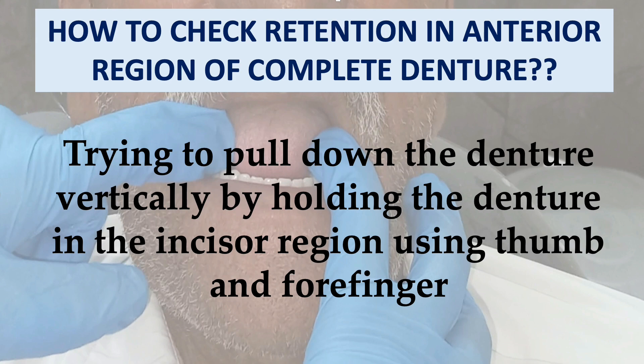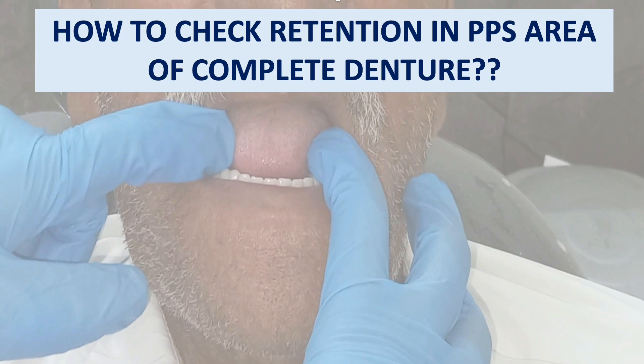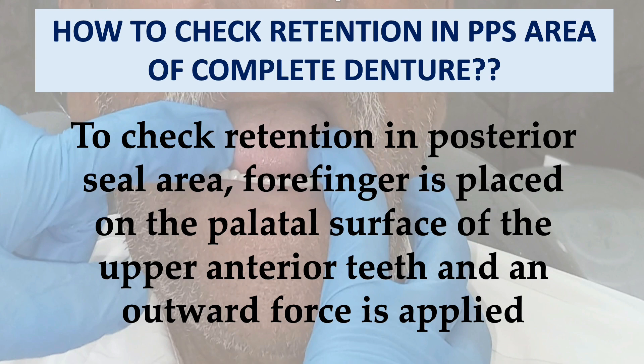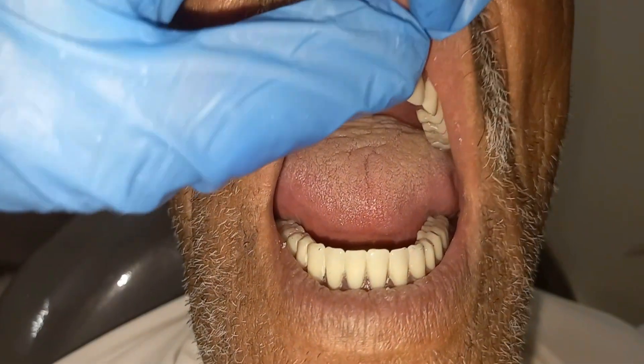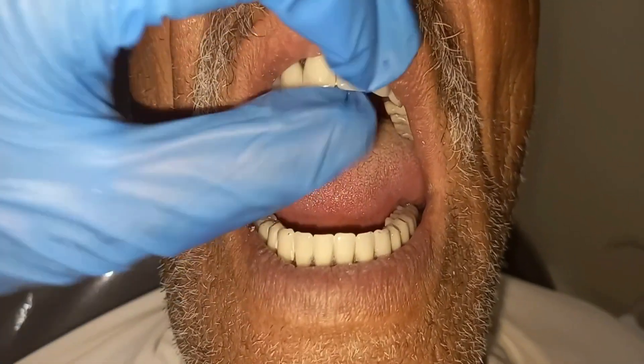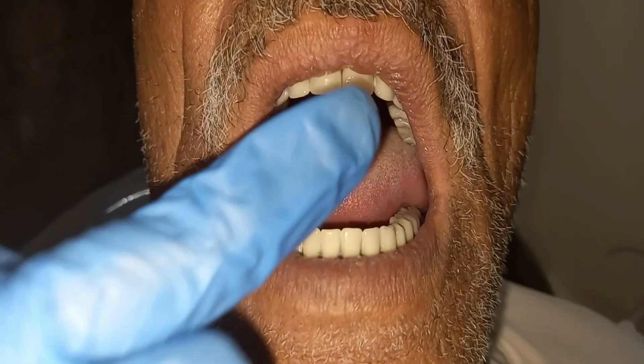By pulling down the denture vertically, you check retention in the anterior region. To check retention in the PPS area of the maxillary complete denture, a forefinger is placed on the palatal surface of the upper anterior teeth and an outward force is applied. If the seal breaks, it means the denture is not retentive and the PPS is not correctly recorded. If the denture does not dislodge, it is completely retentive.